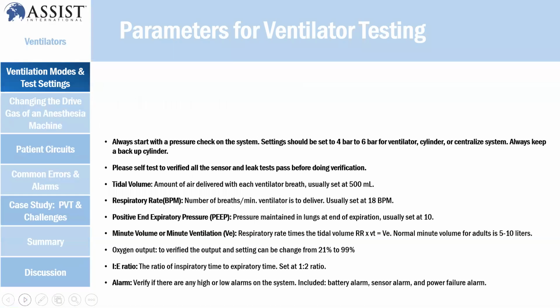VCV is normally referred to as volume control ventilation, and PCV is pressure control ventilation. The terms can change depending on the brand, but the function is almost similar.